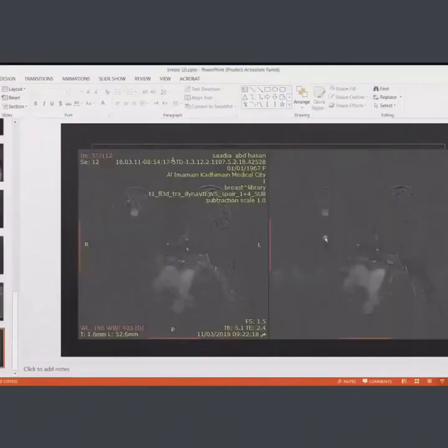This is also another patient with breast carcinoma. You see the spiculation of the border of the mass. So, MRI is for screening high risk patients when the risk is too high, with very strong family history, and in further workup of masses that are indeterminate using other modalities.